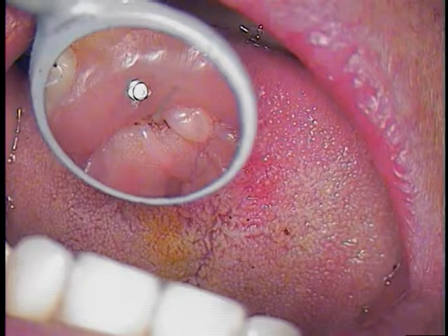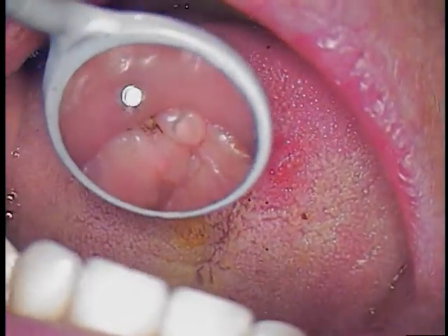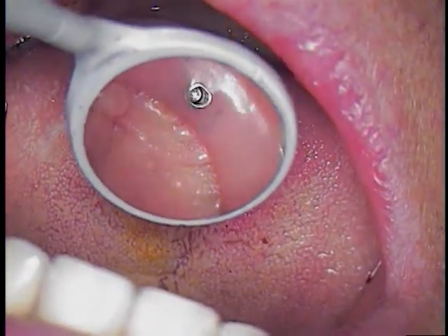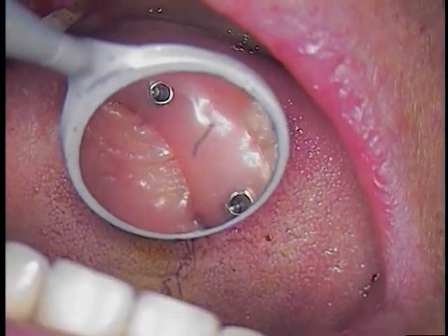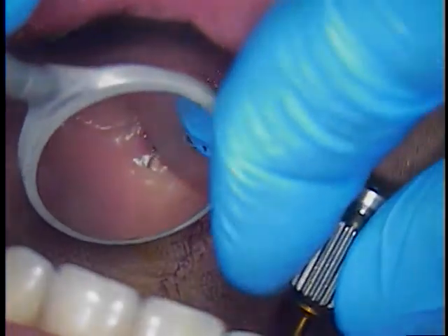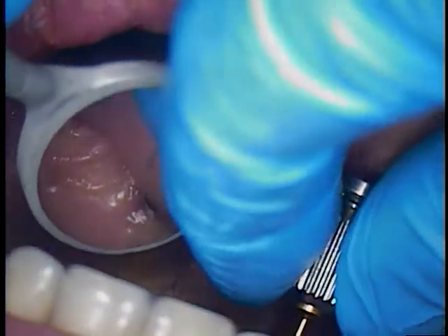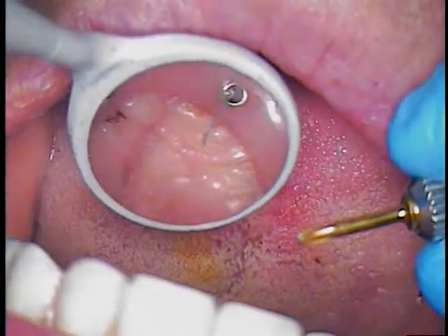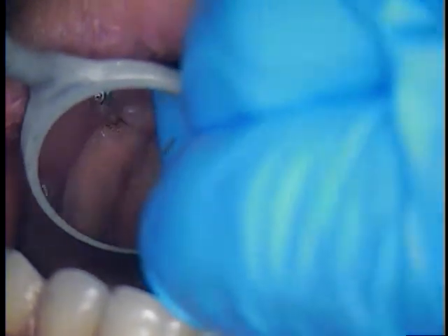We're going to place polyvinyl siloxane in each one of these orifices now. The reason is we may have to be back in there in a week — we hope not to — but we can also recheck the screws, make sure that they all are tight. So very simply, you just go in and place the PVS in this orifice. Then back in a week. Not to worry if one of the plugs comes out — it's not a big deal, as long as everything is securely tight.